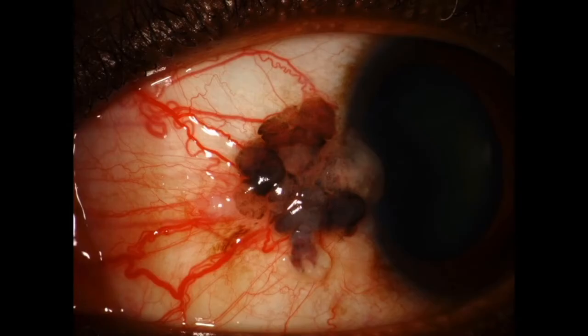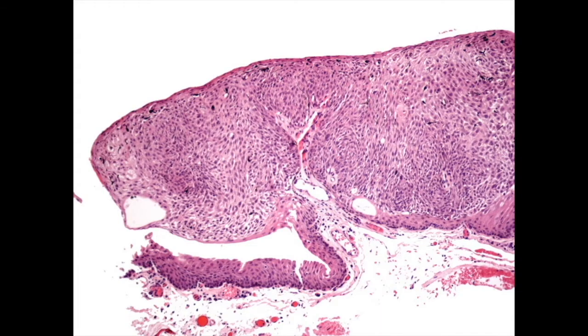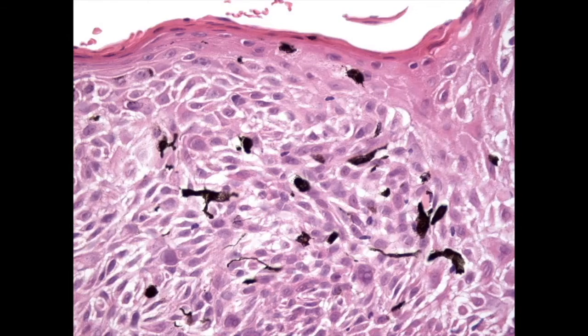In heavily pigmented individuals, squamous cell lesions can appear pigmented. So this is an example of a pigmented squamous cell carcinoma in an African American patient. Here is the histopathology, again, a classic abrupt transition, a sessile papillomatous proliferation, totally replaced by atypical squamous cells. And under higher magnification, we see this reactive melanocytosis. Again, these are not malignant melanocytes. It doesn't take that many melanocytes to make the lesion look pigmented.